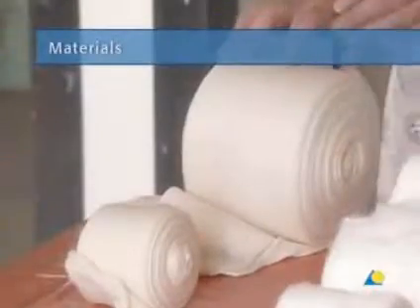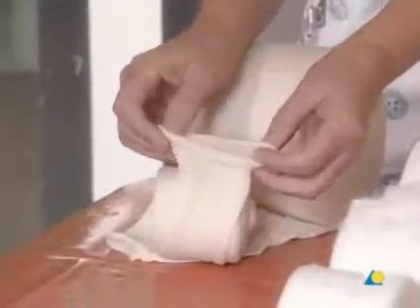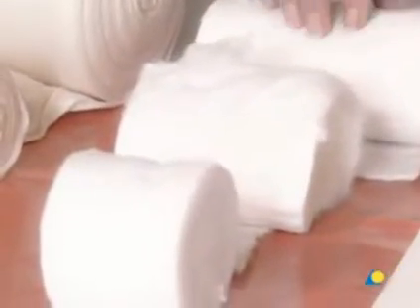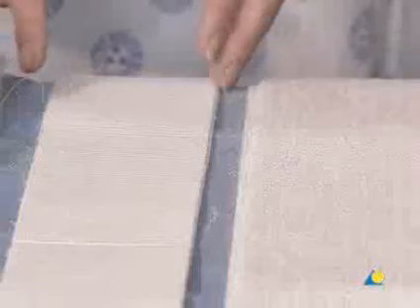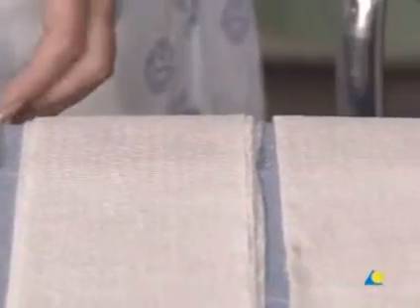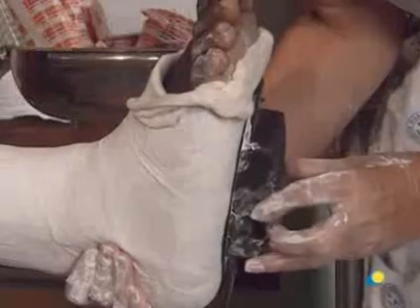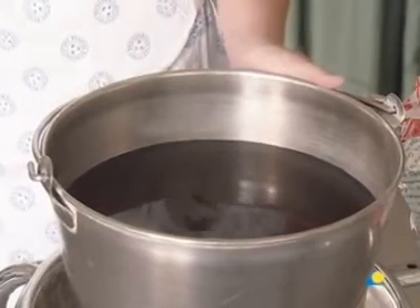To apply a PTB, the following materials are needed: a stockinette or tubular gauze bandage, cotton wool for undercast padding, scissors, plaster of Paris bandages in rolls of varying widths, plaster slabs generally five layers thick and available in differing widths, a walking rubber, and water or another wetting agent.